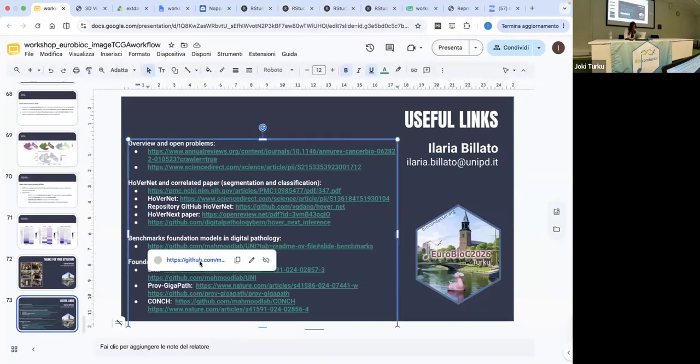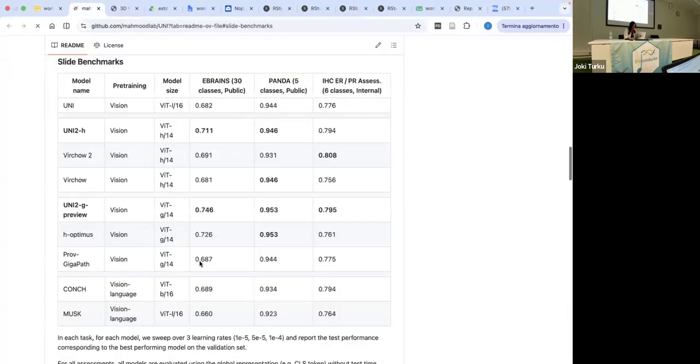Yeah, this one. Here, for example, they use different pre-trained models, for the vision or the language. So they use a model trained on language to predict information from the images. And actually, they did not perform very well, which makes sense, but they also tried that. My personal opinion is that foundation models and convolutional neural networks have different tasks, because with a convolutional neural network, you are able to understand more patterns from the images. You can do segmentation and classification.